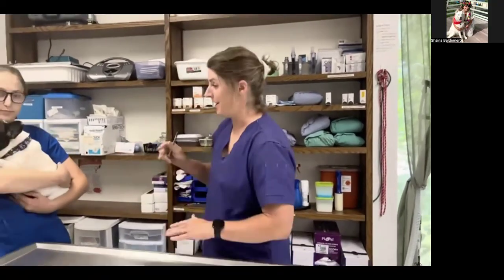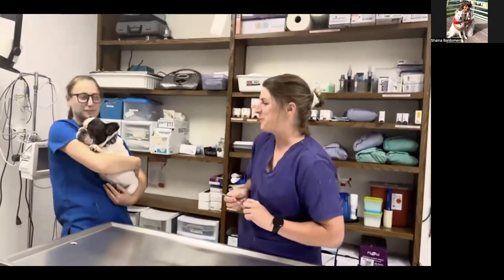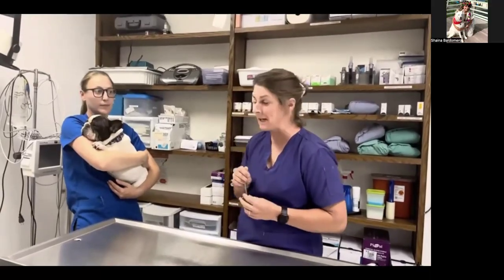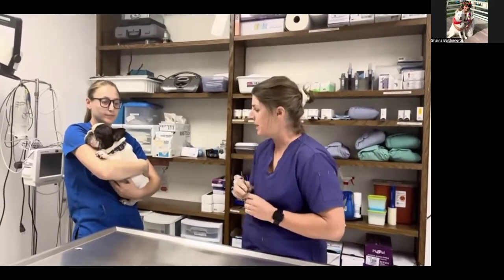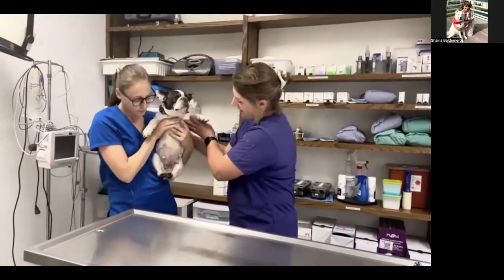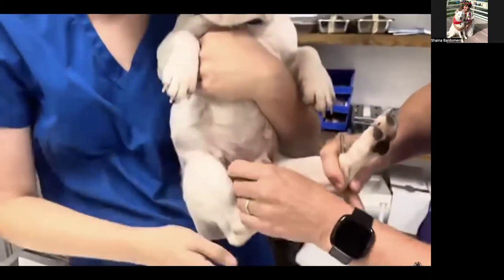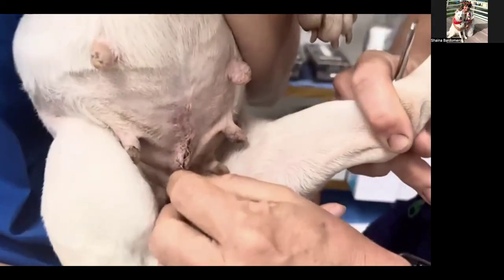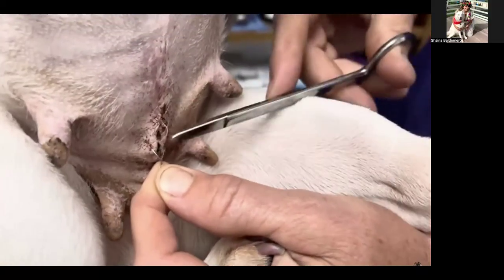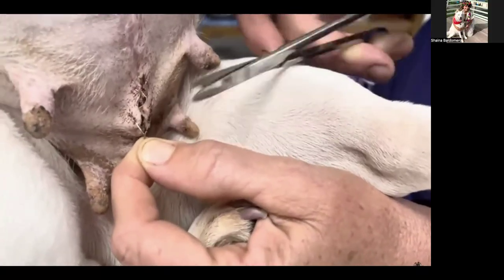So this is Lola. Lola is a rescue French bulldog owned by one of our technicians, and she was a breeding mama in her previous life. So she's kind of got a funky undercarriage here, and she's got some cruciate stitches down low. We've got 3 of them. You see how when I pull on it, we see our knot right there, and then we see 2 sides. I only want to cut one side.